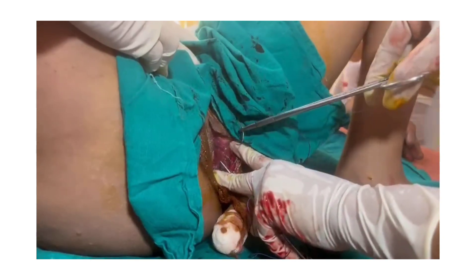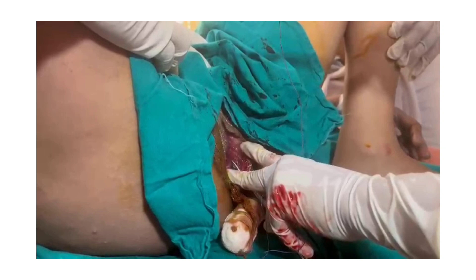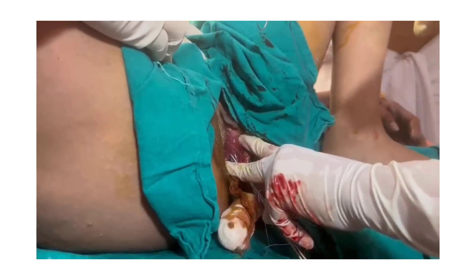The suture material is preferably Vicryl Rapide, but here in this case I am using Vicryl which is not Rapide.